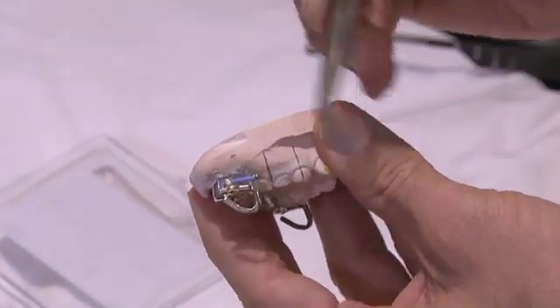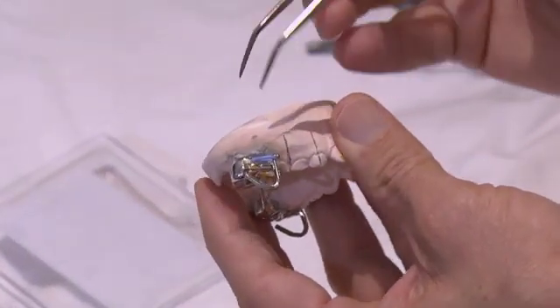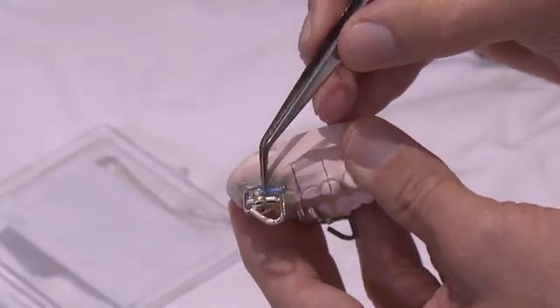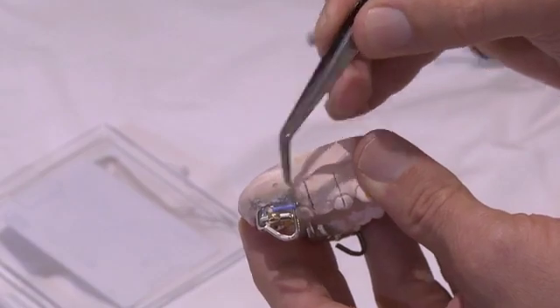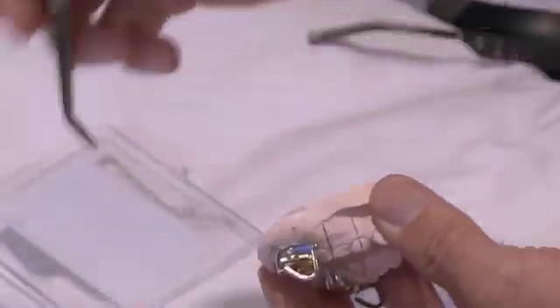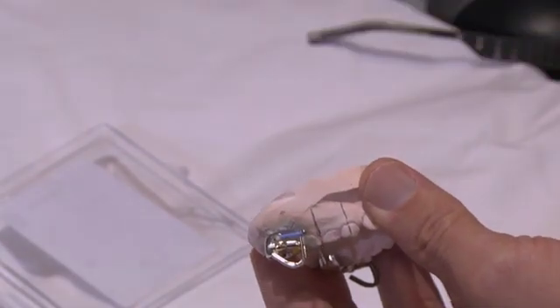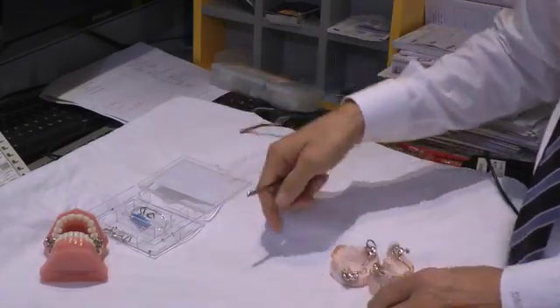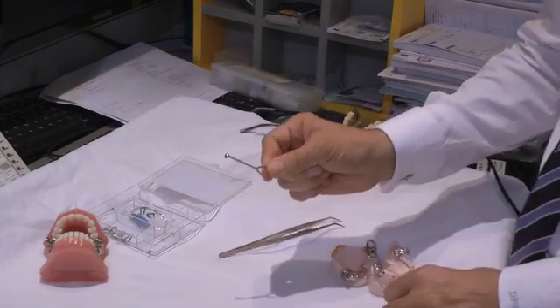Once it's cemented in the mouth, we will remove the rubber component and use the tie-back post to tie it back to our molar tube, which keeps it in place. Then on the next visit, if we want to advance, we will use a ligature cutter to take the ligature tie away, take the arm out of the mouth, add a longer shim, and place that back in the mouth.